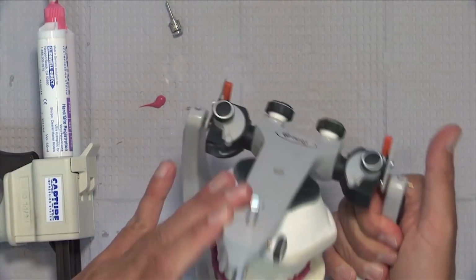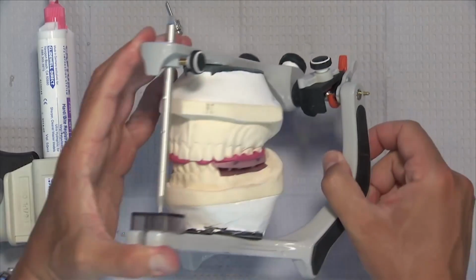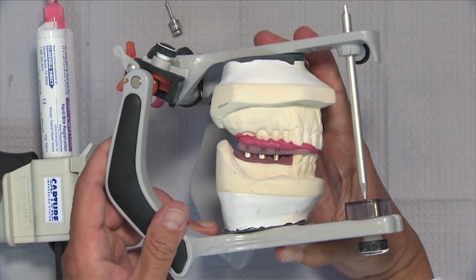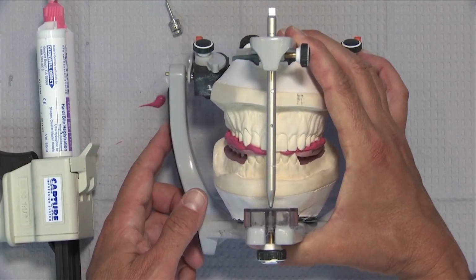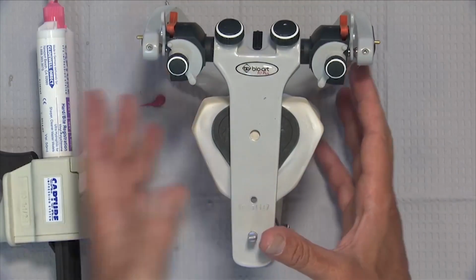And then you guide the patient into closing. And again, you should be able to visually verify that those anterior teeth are touching in maximum intercuspation. And once the polyvinyl bite registration material has fully set, you'll be able to have the patient open and close. You can trim away any excess before you do that and be able to verify that the patient can in fact open and close. So we'll let this set for 60 seconds and then we'll verify that.